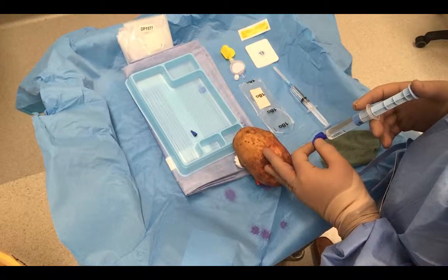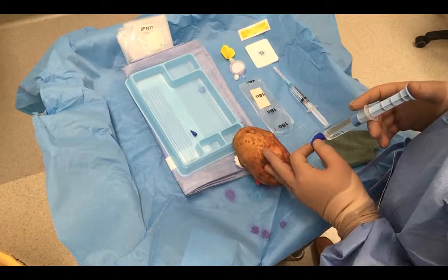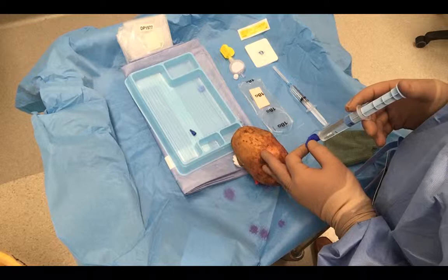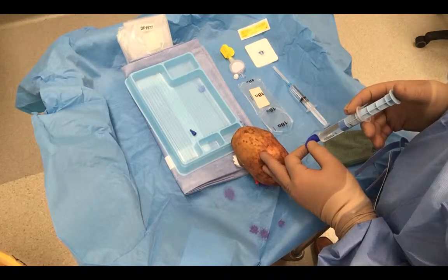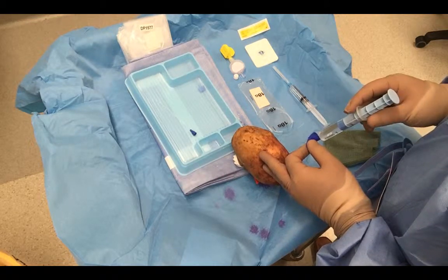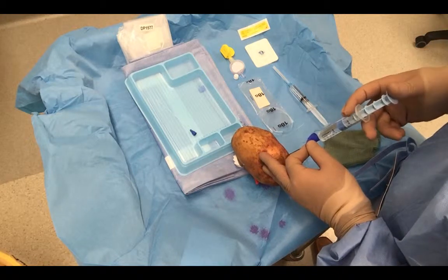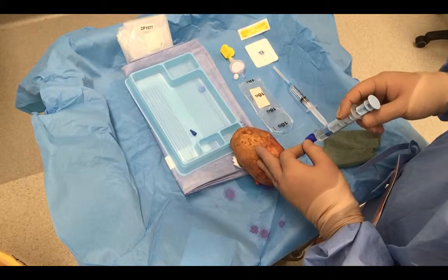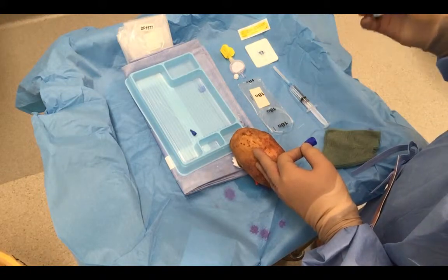So, contact with the patient, advancing with smooth pressure on the plunger, restricting, waiting for, and there's a loss of resistance. So, clear loss of resistance. What's very common now is to hydrodissect that space with some saline. 4 or 5 mils of saline should be more than enough.